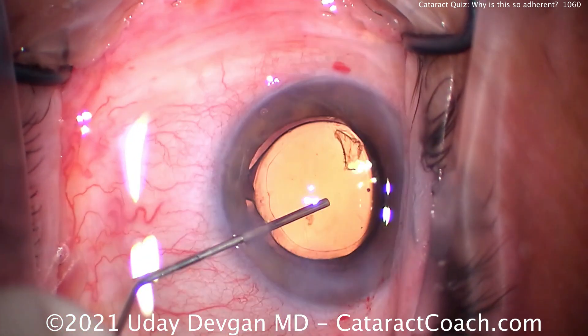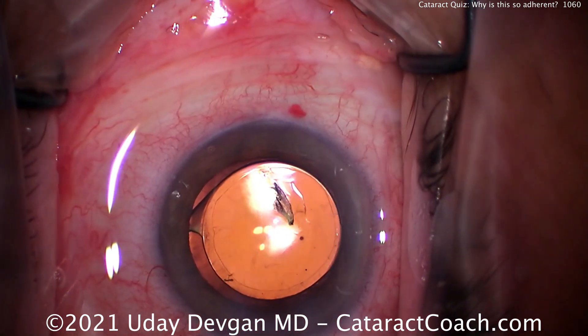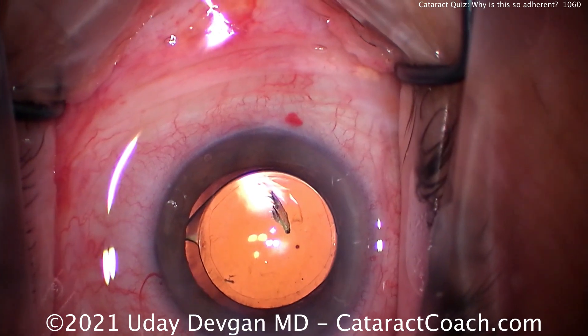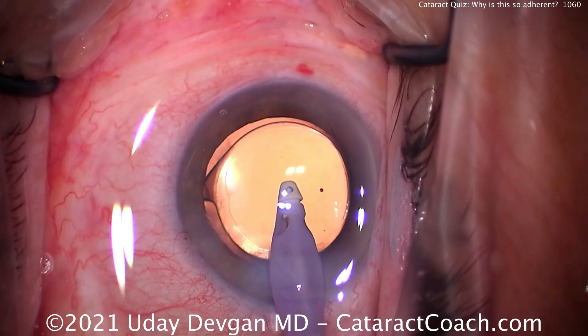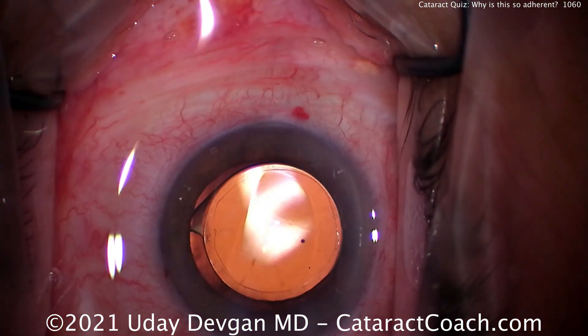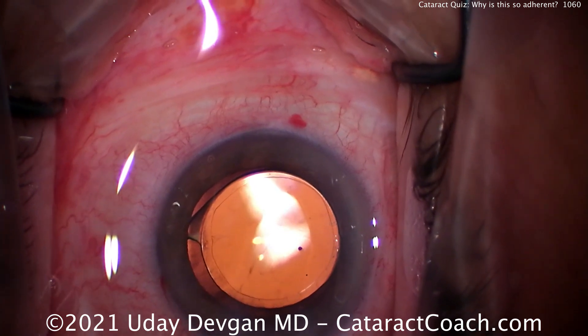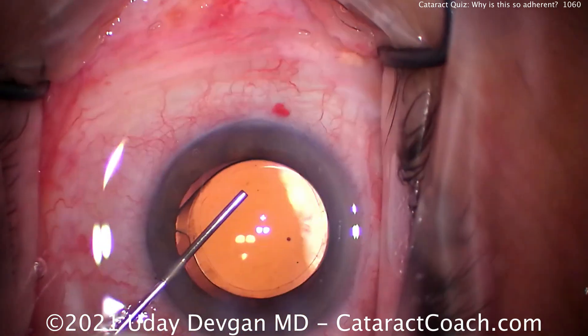But luckily in this case we were able to be very careful. And oh, look what we found here with that angle sweep — this is why I recommend the angle sweep at the end of every case, because you may inadvertently trap little pieces like that in the angle of the eye in that viscoelastic. Now you can see the overlap of the optic by that rhexis — that's a really good-looking capsular rhexis.